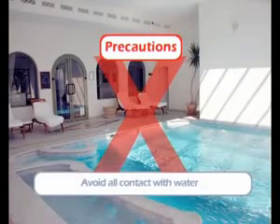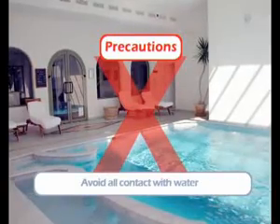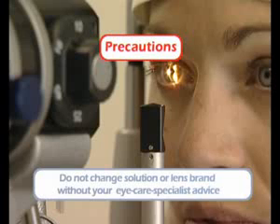Avoid all contact with water. Wearing your lenses in an aquatic setting is not recommended. Do not change solution or lens brands without speaking to your eye care specialist.